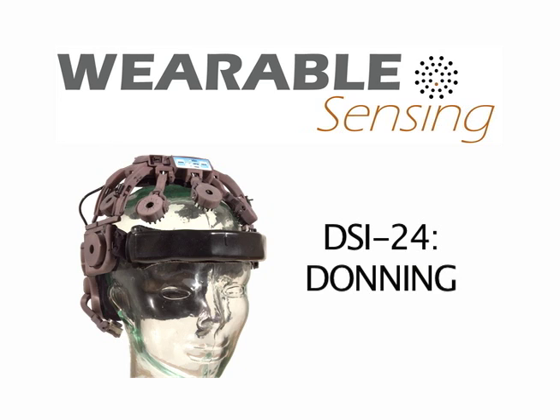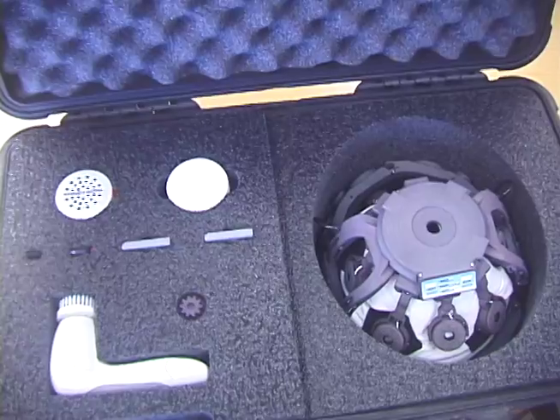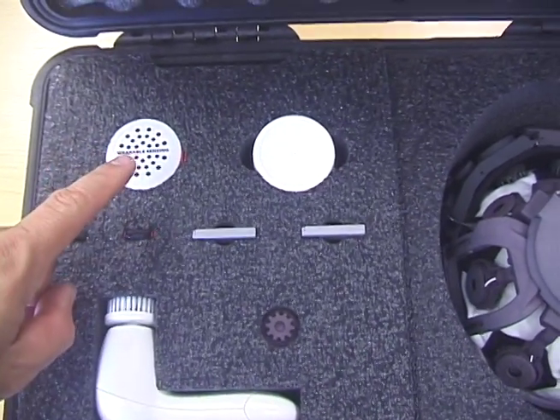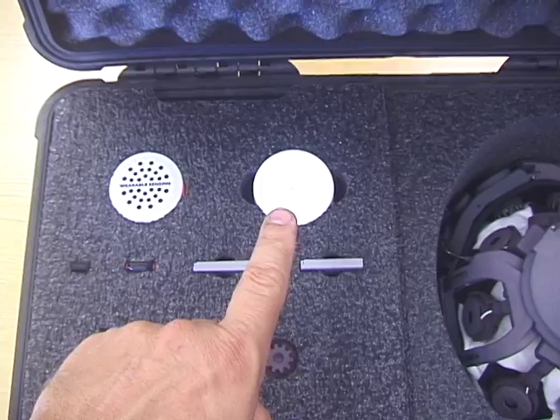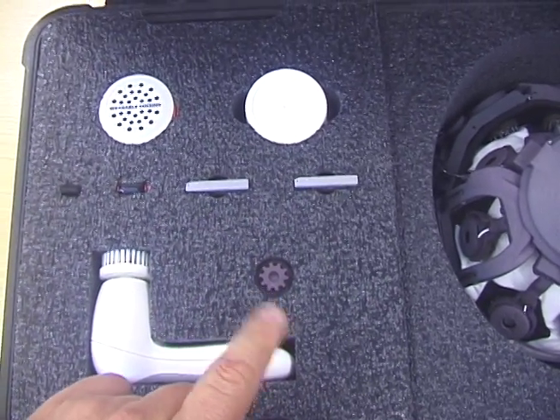This video shows the donning process for Wearable Sensing's DSi24 EEG headset. Inside the ruggedized case for the DSi24 you will find a tape measure for measuring the circumference of the subject's head, a Bluetooth dongle, a USB flash drive containing software, two batteries, some cleaning fluid, a motorized cleaning brush, and the adjustment tool for the electrodes.